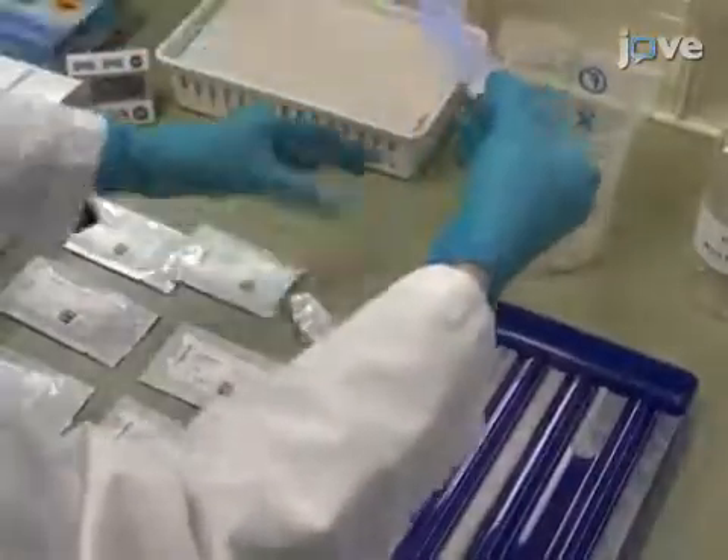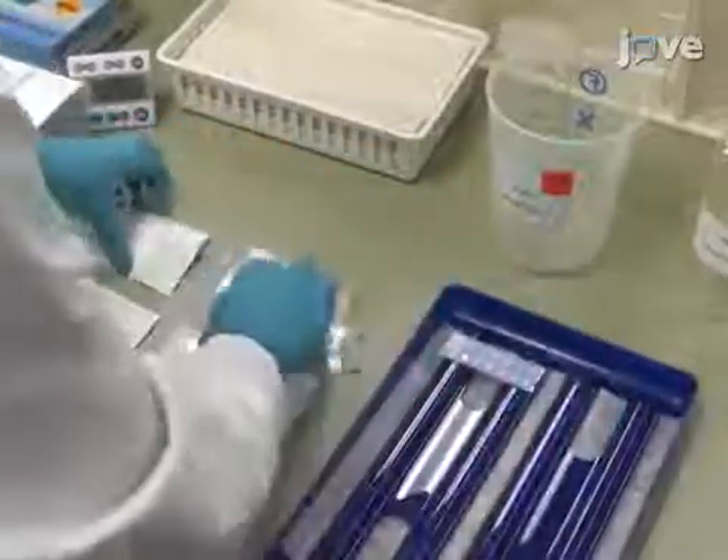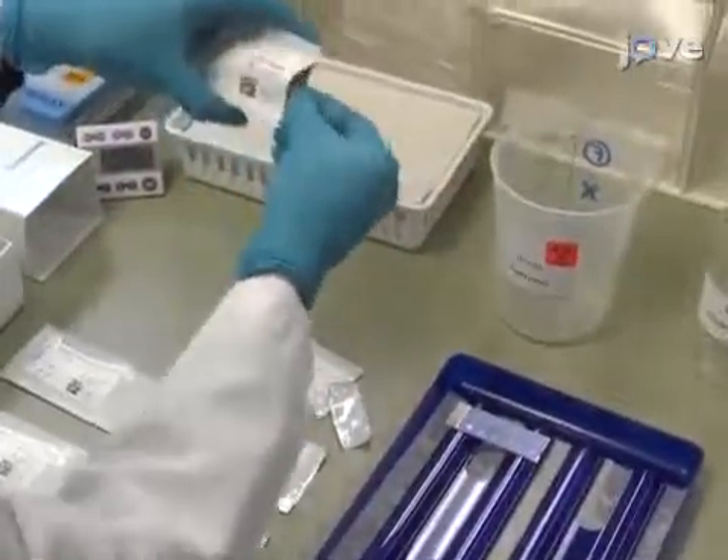Once equilibrated to room temperature, carefully remove the substrate slides using one's fingers, avoiding contact between the slides and the sides of the pouch.